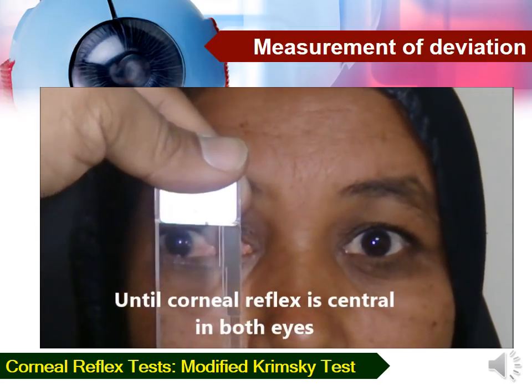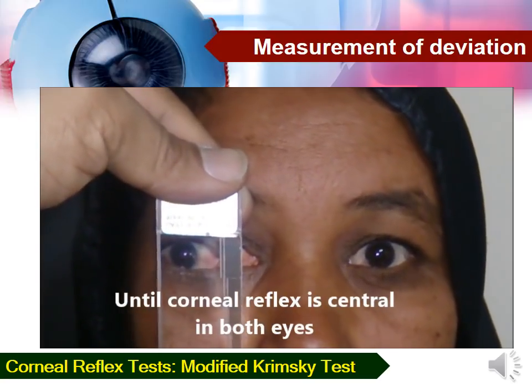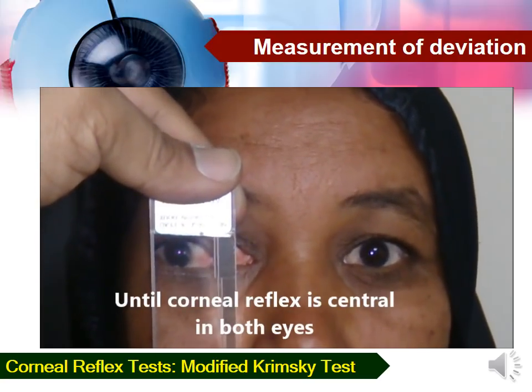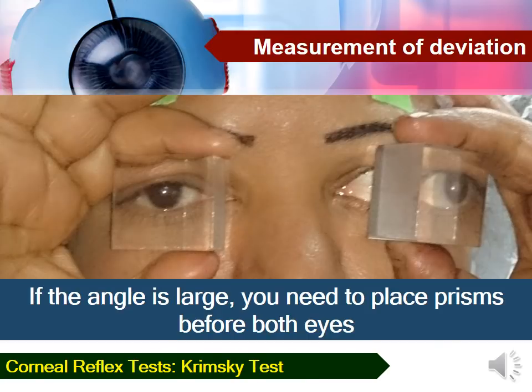You gradually increase the prism power until the corneal reflex is in the center of the pupil of both eyes. The prism power is equal to the angle of deviation. If the angle is too large, the larger prism power won't be able to bring the light reflex in the center of the pupils of both eyes, so you need to place a prism in front of both eyes. However, the details of measurements of large angles will be discussed in a separate presentation.